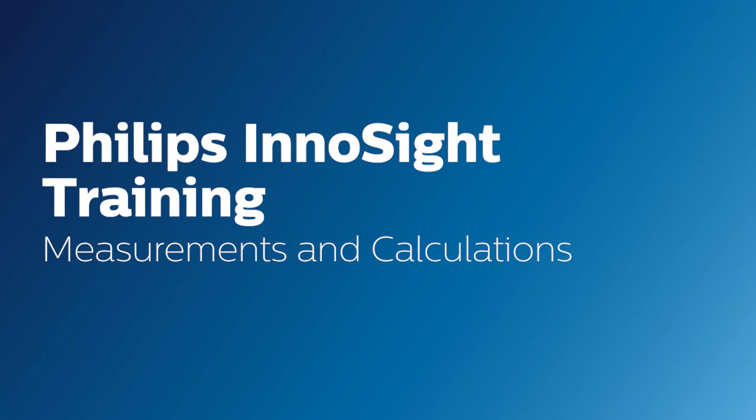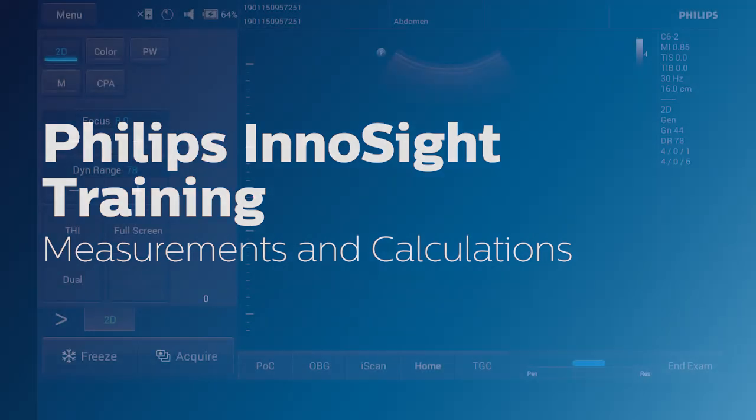Hello. Today we will go over how to create, edit, and perform measurements and calculations on your InnoSight system.